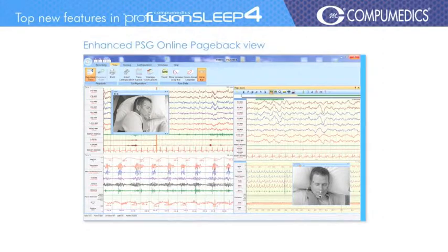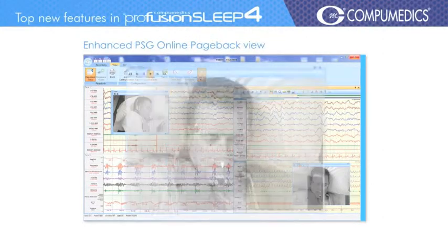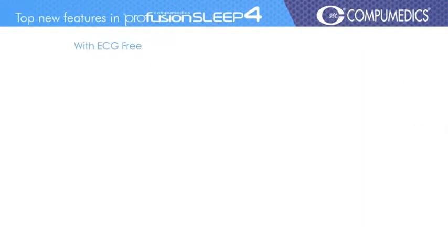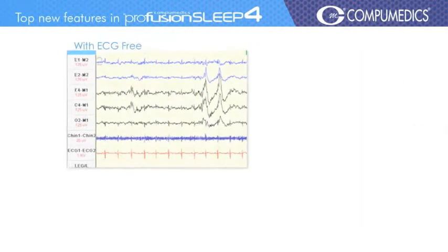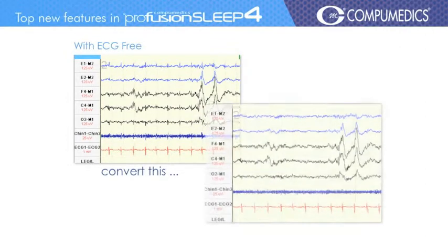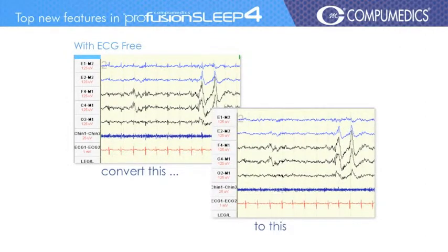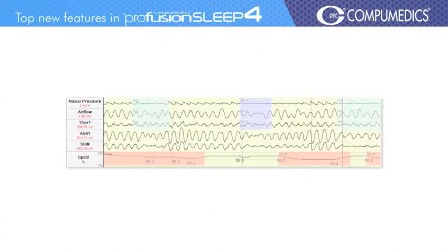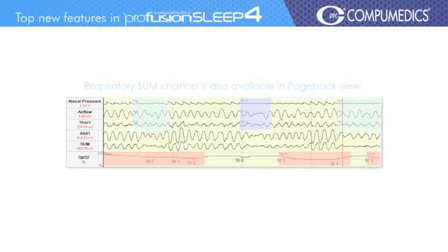Profusion Sleep 4 has an enhanced PSG online pageback view with video review and ECG free trace transformation, which allows you to score during pageback without ECG artefact. The respiratory sum channel is also available in pageback view.